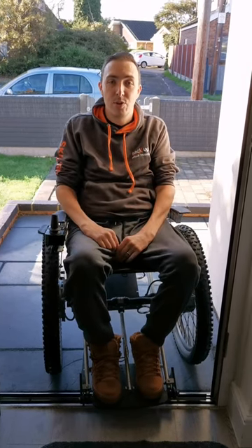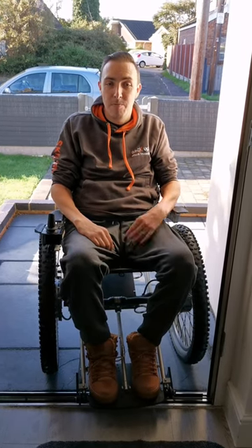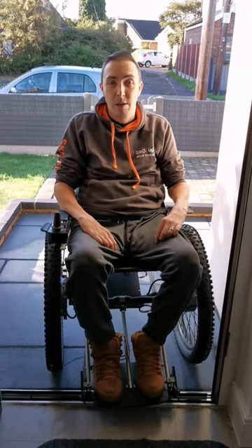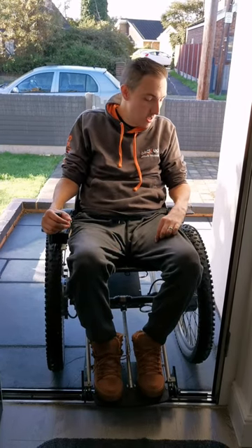My advice is to practice in the particular chair that you have to build your confidence. This particular chair I typically use when I can't independently push in my manual chair out and about. That being said, I will transfer into my manual chair in the house, so let's get inside.